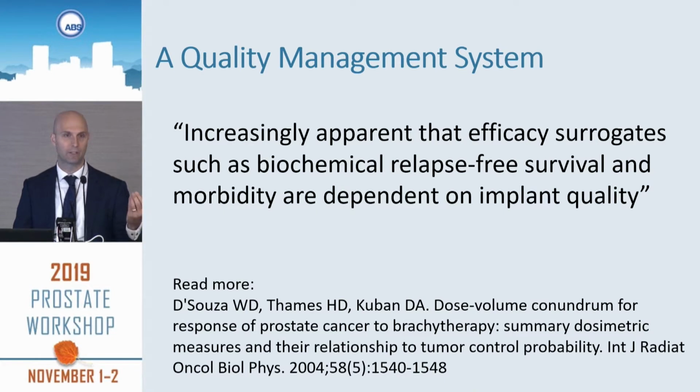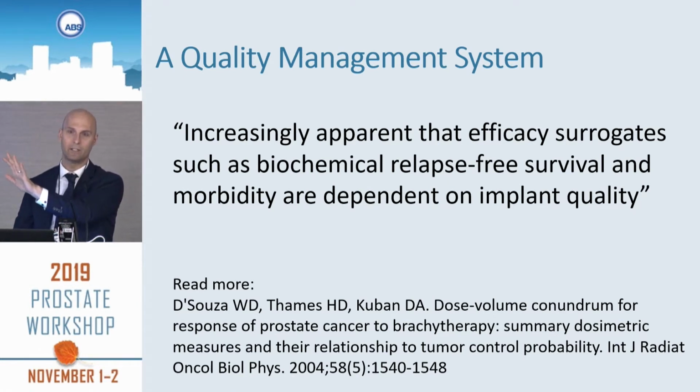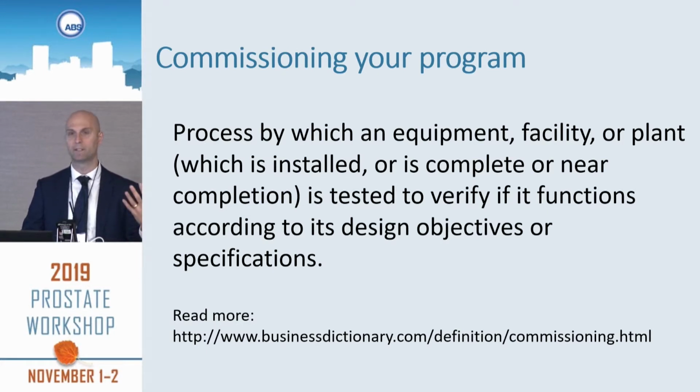Firas mentioned that I'll be discussing a quality management system. And if you imagine then that what you want is a high-quality implant, and that depends on having a high-quality program. And that really is going to be having high-quality procedures and processes. And so I want you to focus that that's kind of your role, is that in the end, that does lead to a good impact and outcome for the patient, but it all really starts at the beginning with commissioning and the physicists. So commissioning your program, that'll be the process by which the equipment, the facility, the plant, this is a generic process, not just radiation oncology, where you test to verify that it functions according to its design and its specifications.